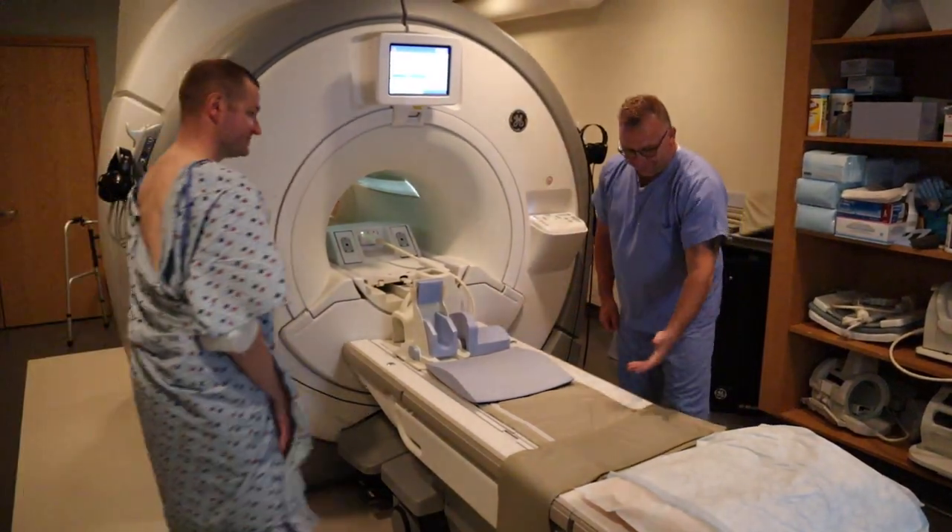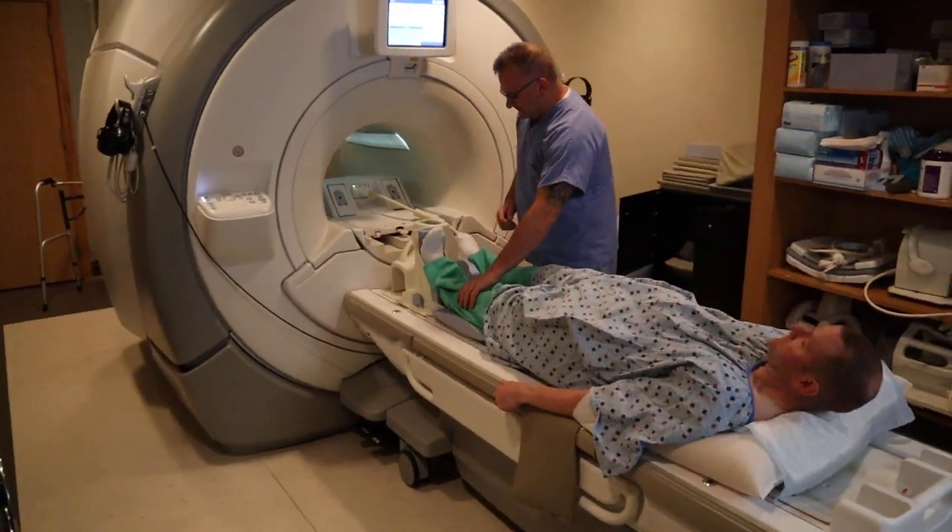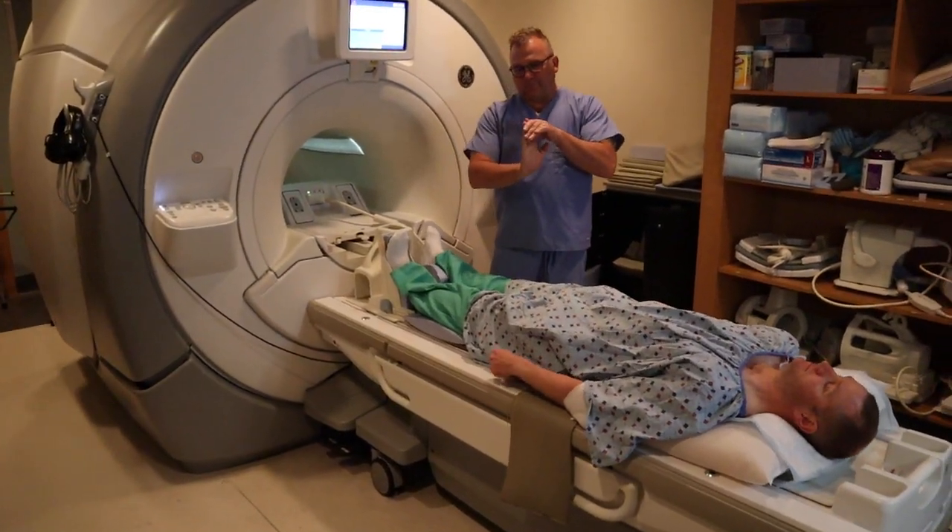We're now going to position for an MRI foot and ankle. You want to ensure that the patient is laying flat on their back and their ankle is at 90 degree dorsiflexion.